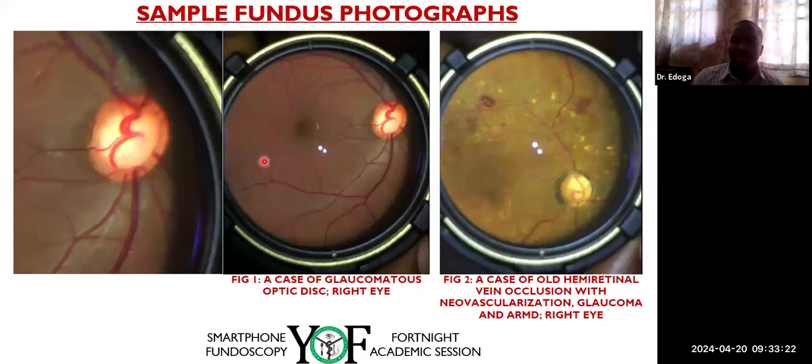All right. So the rest of the retina is essentially normal. Where you have an issue is this. These two light images, you are going to be seeing in most smartphone fundus photographs because they are images coming from the anterior and the posterior lens surface. They are Purkinje images coming from the posterior and the anterior surface of the lens.